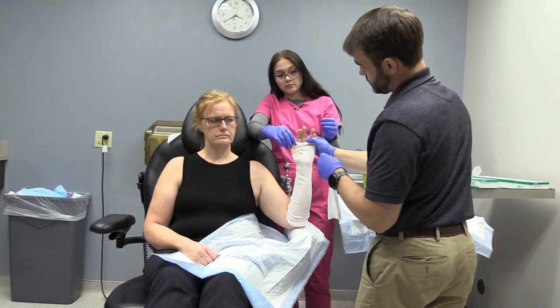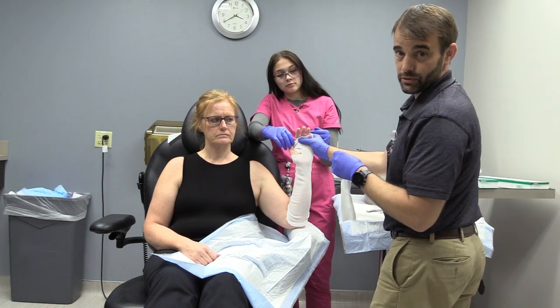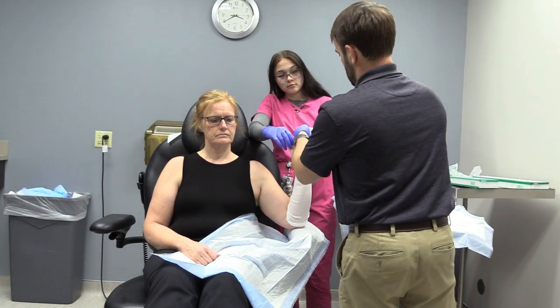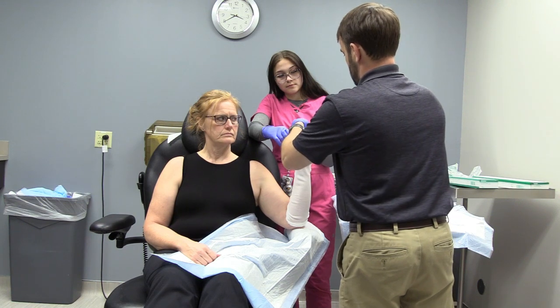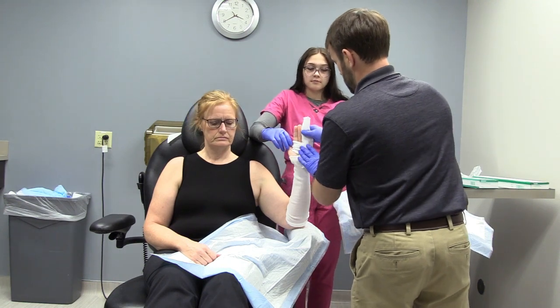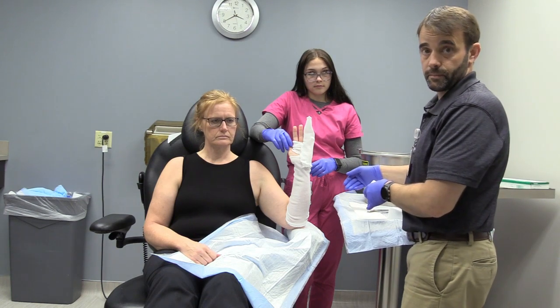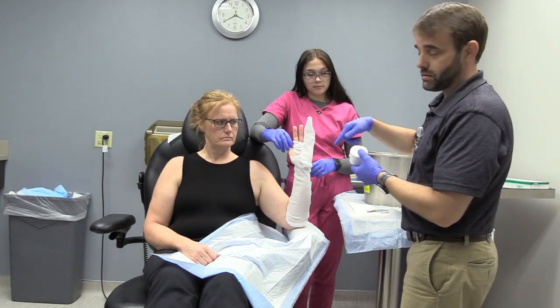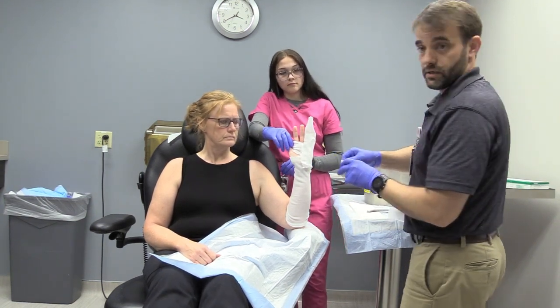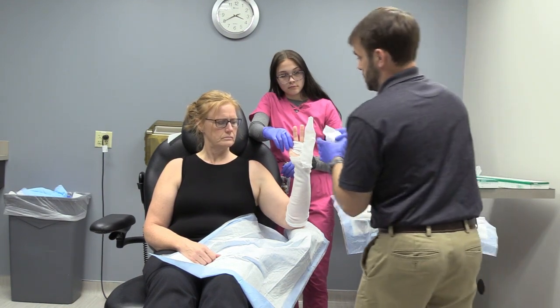And you'll include these two fingers for a fifth or even a fourth. If it's in the middle, then you'll probably include all four fingers and just leave the thumb free. So we'll just do two for now. And then there are two ways to pad. Some people pad the plaster, which is an option. I usually like to wrap the hand or wrist first, just so I know the padding's there, and then I can work with the plaster independently. But if you want to just put padding on the plaster like you would with orthoglass, that's okay too.